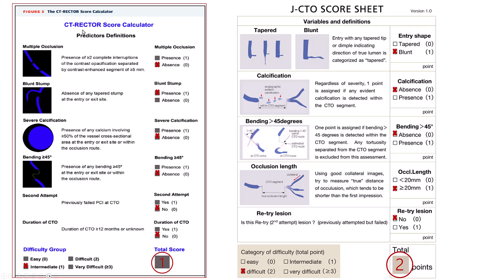There is a score specific for CTA called the CT-RECTOR score, which is the most commonly used. It is similar to the JCTO score and looks at the presence of multiple occlusions in the vessel, blunt stump, presence of severe calcium, intralesional bending more than 45 degrees, previous failed attempt, and duration of CTO. Based on this, one can have a score that correlates with the difficulty of crossing the CTO. In our case, the only adverse factor was the lack of a tapered stump — he did have a blunt stump at the proximal cap.